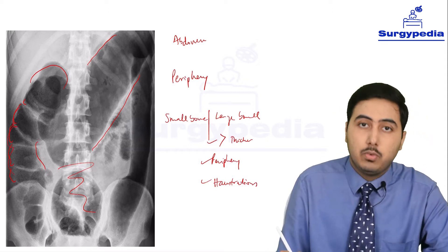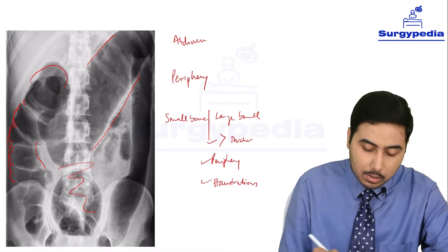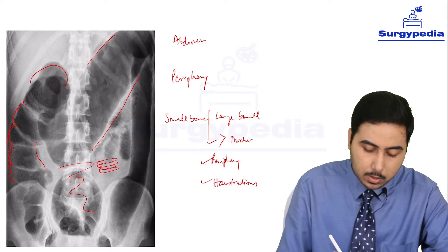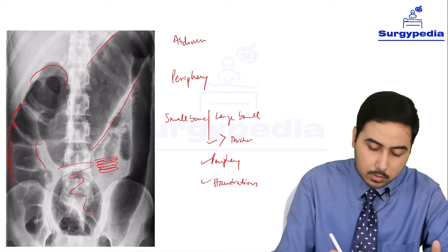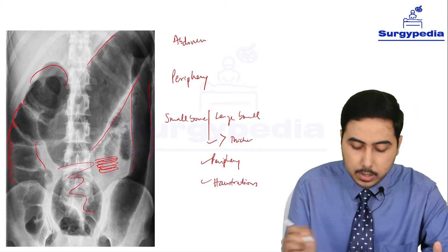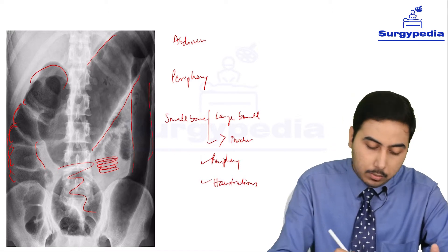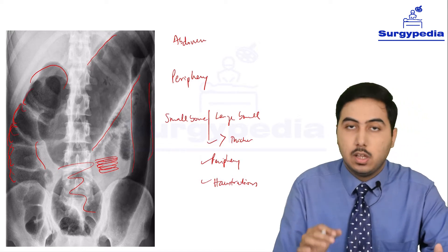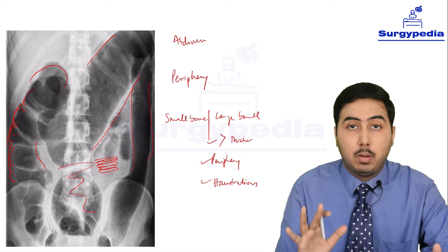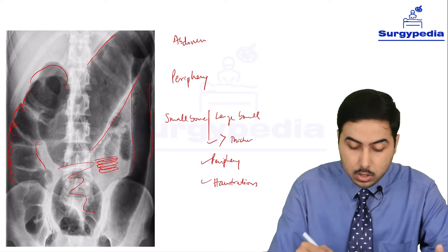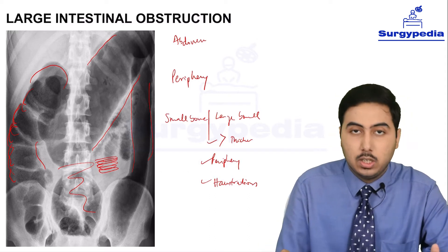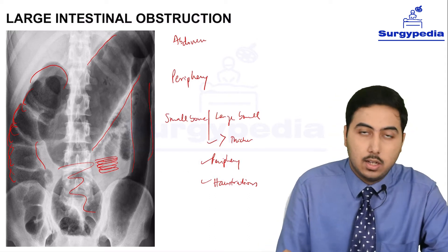In small bowel obstruction, we would have got valvulae conniventes. But here we are getting nothing of that sort. This part is completely plain, but we are getting haustra markings. And this is classical large bowel obstruction. So this is an image showing large intestinal obstruction.